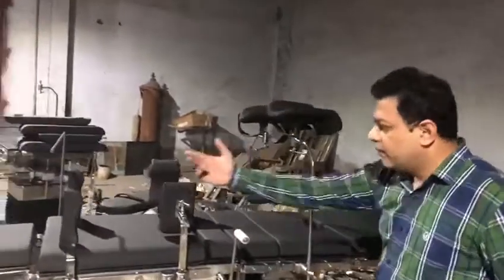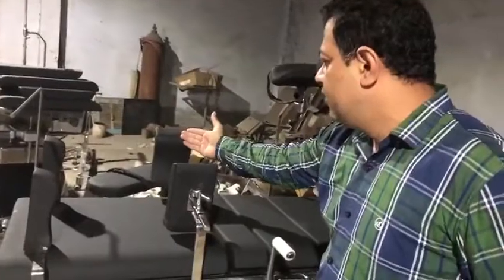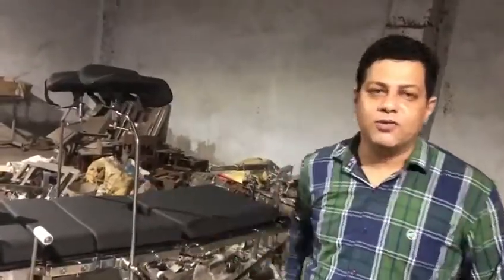We have shoulder support, an anesthetic screen frame, side support, armboard and leg holders. I hope you like this item and my reading. Thank you.